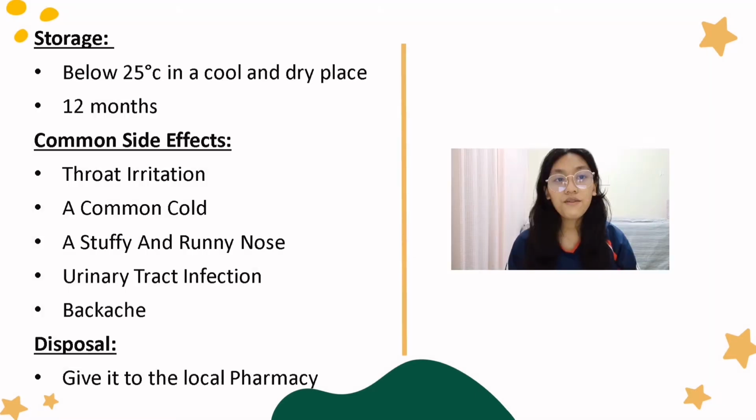Then we have the storage. The Rotahaler inhaler should be stored below 25 degrees Celsius in a cool and dry place. The Rotahaler can be used daily for up to 12 months.